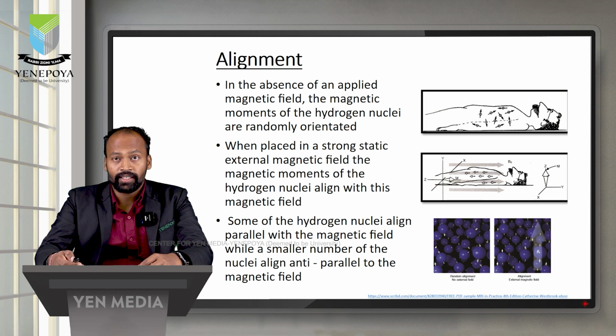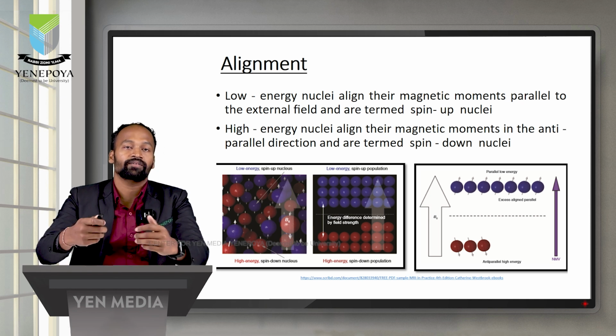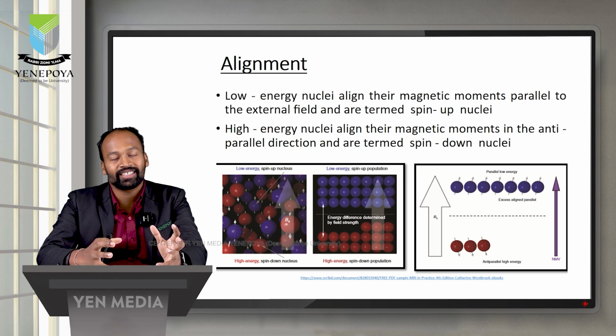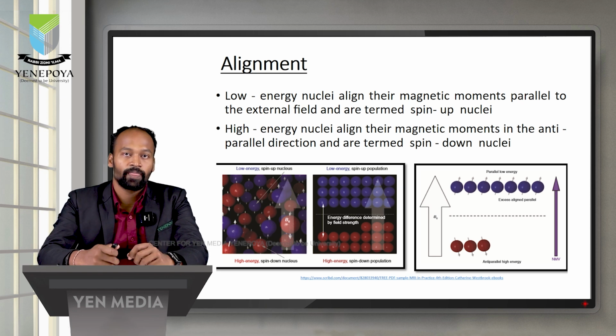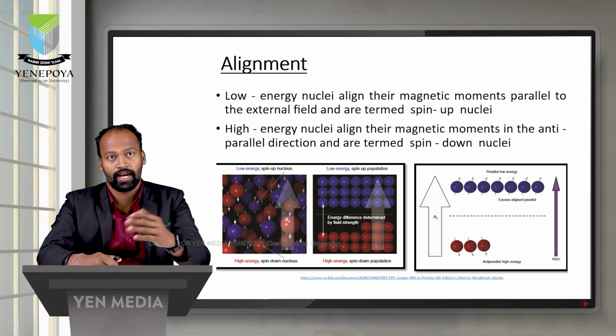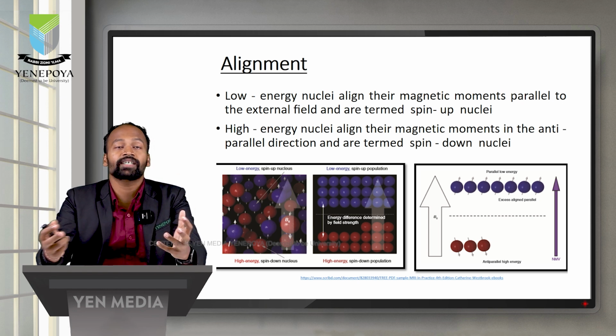In the next slide we can see the low energy nuclei, whose magnetic moments are parallel to the external magnetic field, because of the external magnetic field we are applying. And some of the high energy nuclei will also be present in our body.